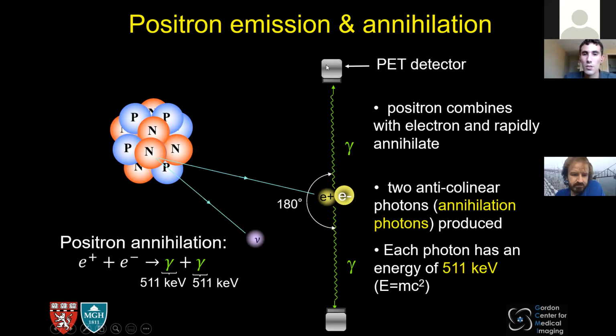And the goal of the PET scanner is going to detect those two photons, okay? In PET, because you do not have collimators, you really need to detect the two photons. So you need to detect a pair of gamma photons, because if you detect a pair, then you know that the site of annihilation is somewhere between the two detectors, and that's how your signal is collimated, basically. So a huge component of the PET scanner is going to be to process those photons and assign them to pairs. So look at the timing information for those photons, and decide whether they are likely to form a pair or not, okay? So that's how the signal is collimated in PET, okay?